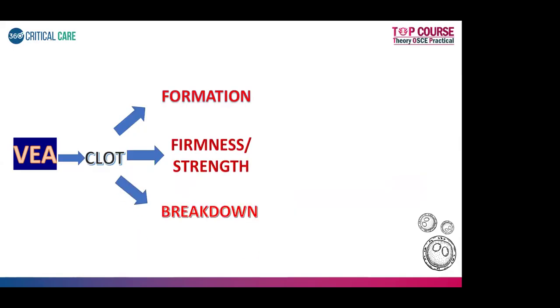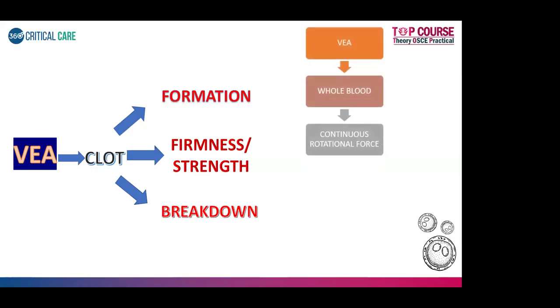So you answered it in the right way also. Usually, remember it's a process, right? So there is an injury. Then with the injury, you have to get the clot formation first. And then after the clot forms, it has to get some strength. And then there is breakdown, which usually should not happen quickly, right? That is what is usually seen in viscoelastic testing, be it TEG or ROTEM. So what is the working principle here?